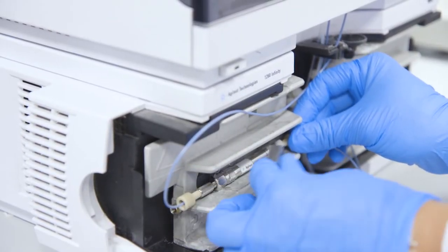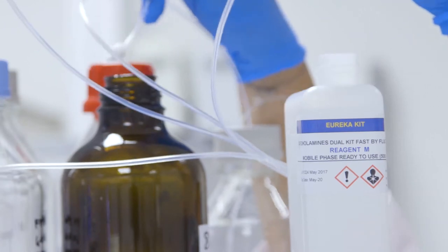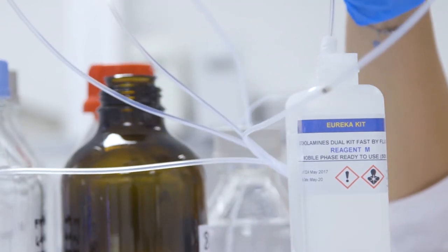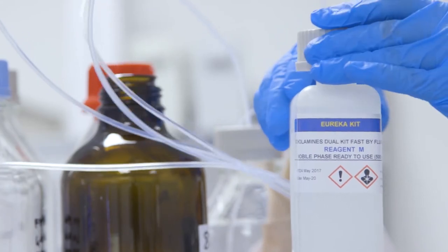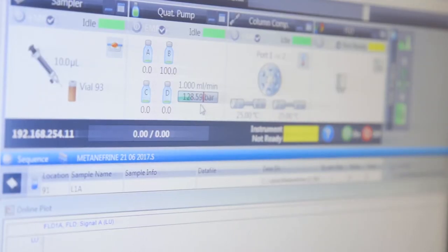Insert the floater into the mobile phase reagent M and let the pump flow at 1.0 milliliters per minute for 15 minutes. After this we will be ready to make the first injection.